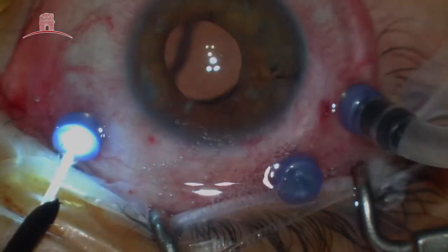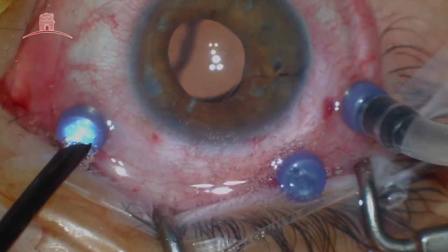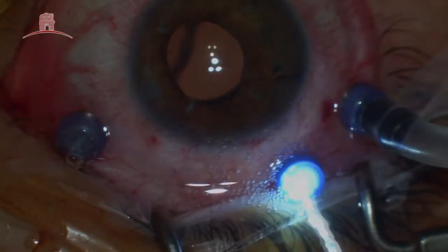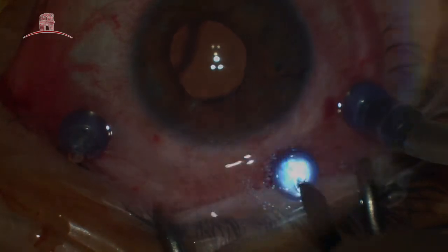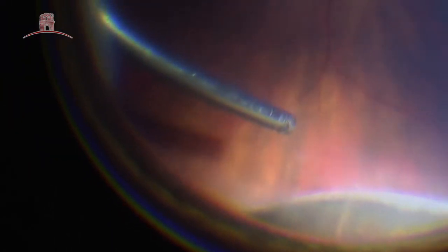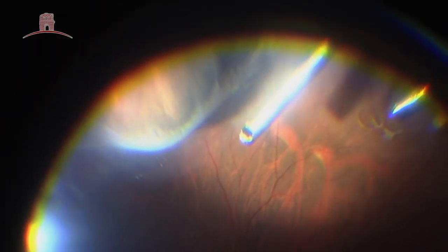The possibility of changing the chandelier's trocar allows access to the entire retinal periphery, since the assistant may reorient the fiber cable at will in order to provide the best lighting to the treated area. Indentation by the surgeon himself allows safe access to the extreme retinal periphery. Combined with excellent visualization, the indentation facilitates all peripheral maneuvers.